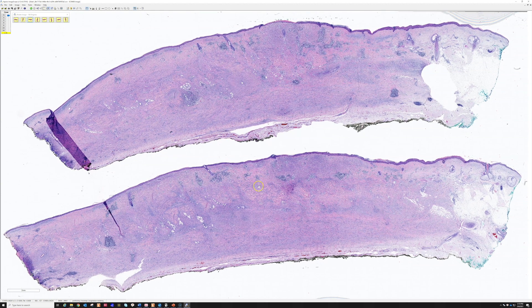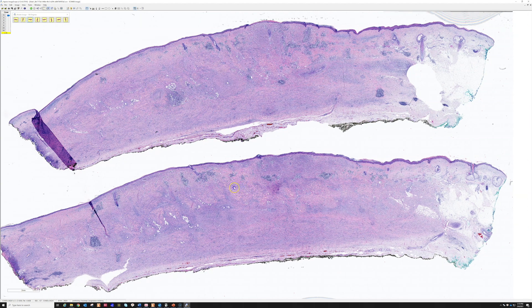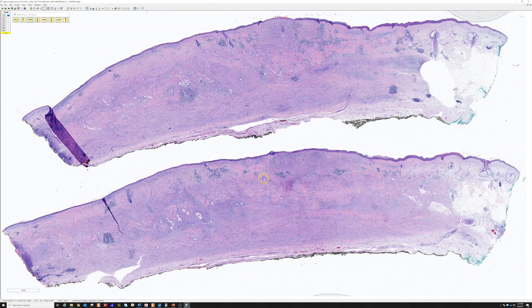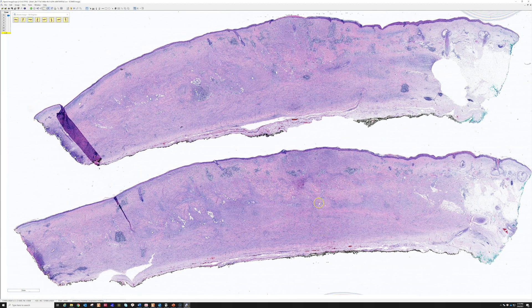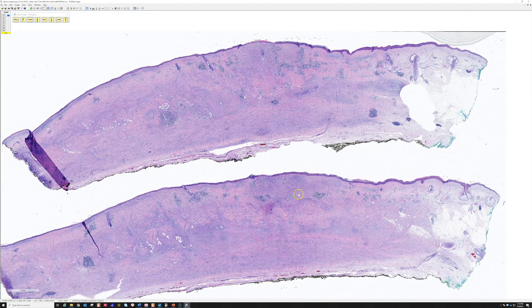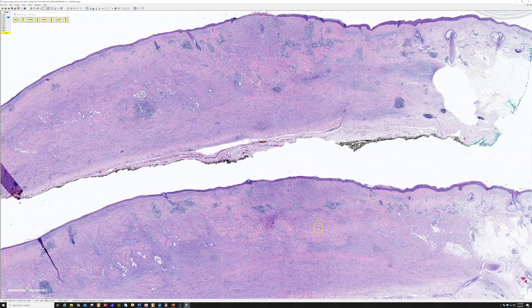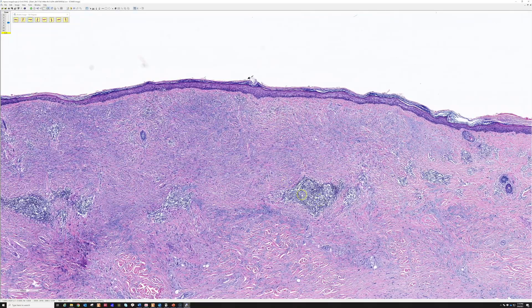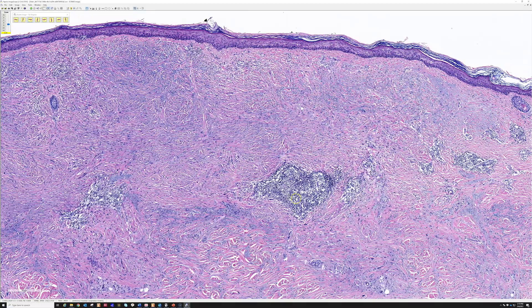From low power, you can see solar elastosis - blue sun damage - and then suddenly that disappears and is replaced by this process. The fat is also replaced. Look at these little aggregates of blue, which will be important as we zoom in closer. Those blue aggregates are lymphocyte aggregates.